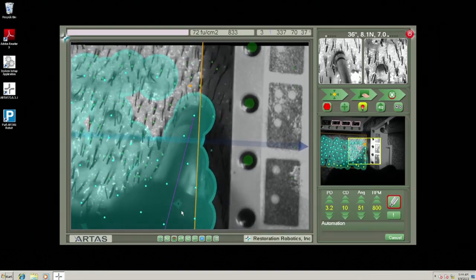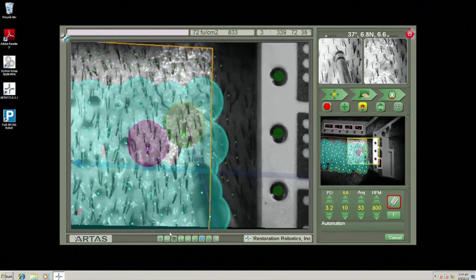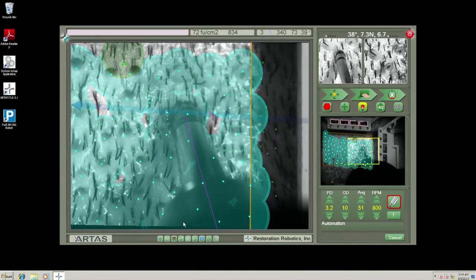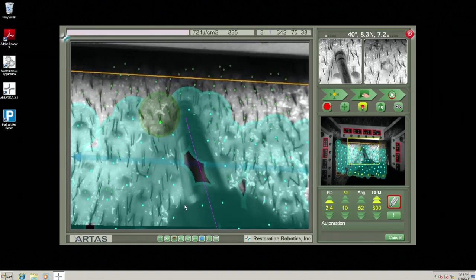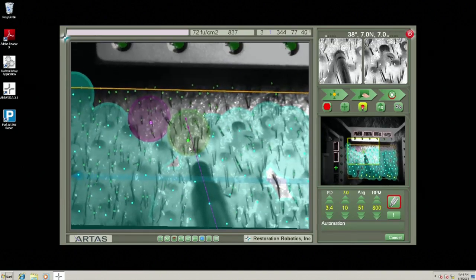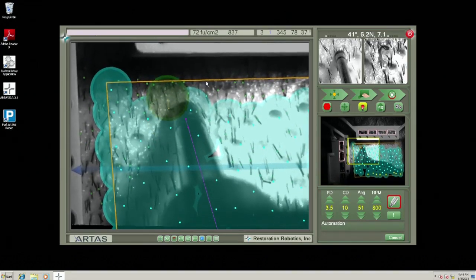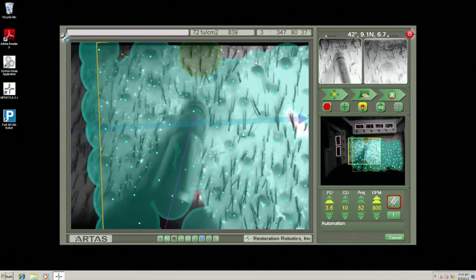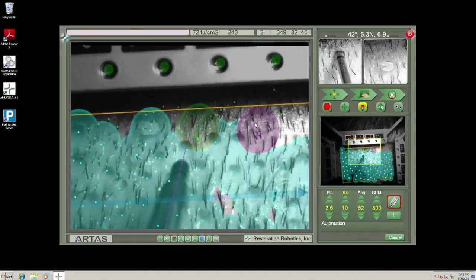Now, if we're really trying to make this thing work really fast, we won't always use a safety flush in between each grid. If we have a dry field like we do today, the field is very dry, we don't have a lot of oozing, then our vacuum system probably is not tainted with a lot of dried heme. Then we can always force drag away, reposition the tensioner, and then reacquire by force dragging right in. Now that will modify some of the metrics on the case, but it allows you to get the case done and shave off anywhere from probably about 45 seconds to a minute.